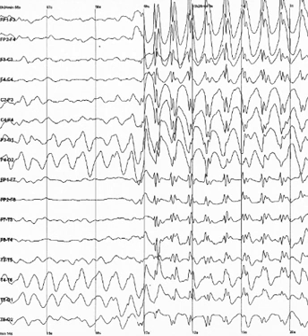Poor grounding of the EEG electrodes can cause significant 50 or 60 Hz artifact, depending on the local power system's frequency. A third source of possible interference can be the presence of an IV drip. Such devices can cause rhythmic, fast, low-voltage bursts, which may be confused for spikes.